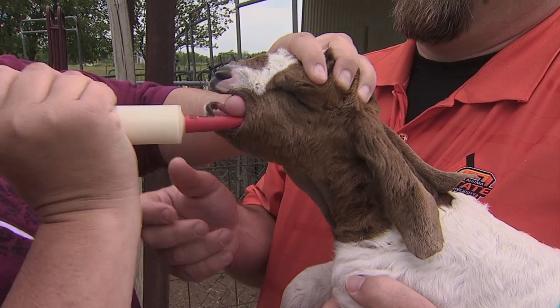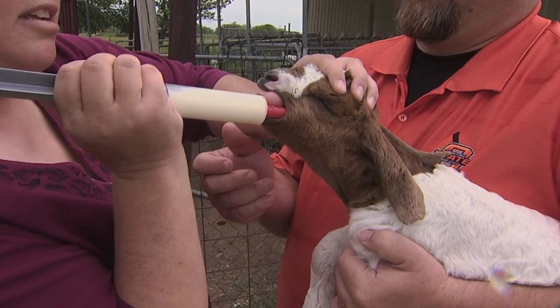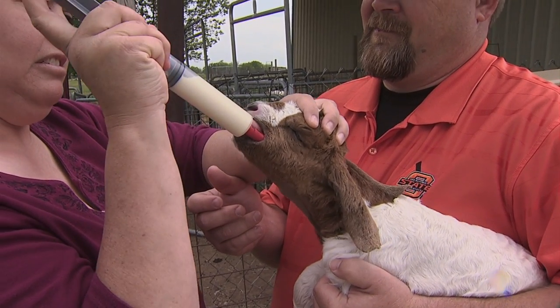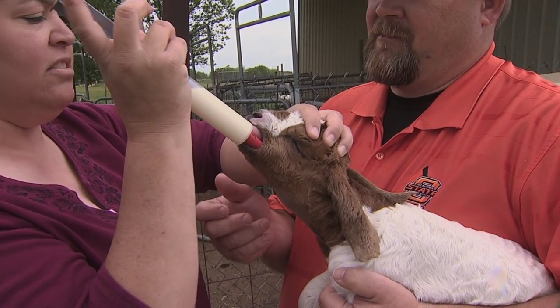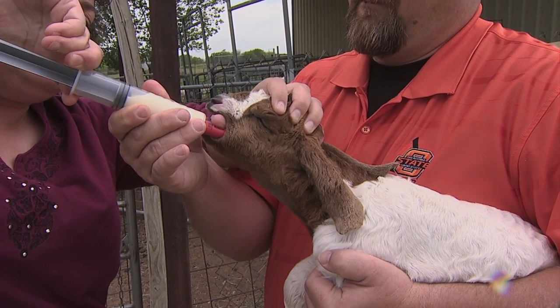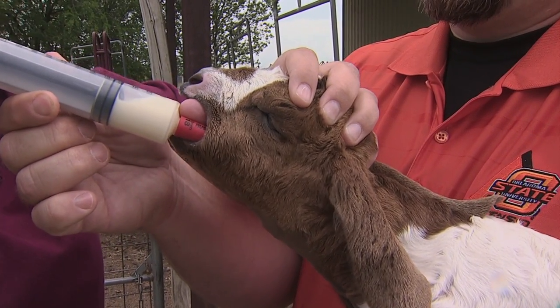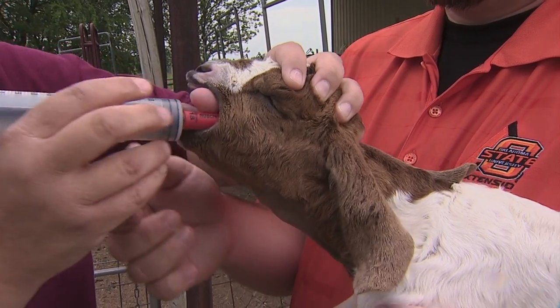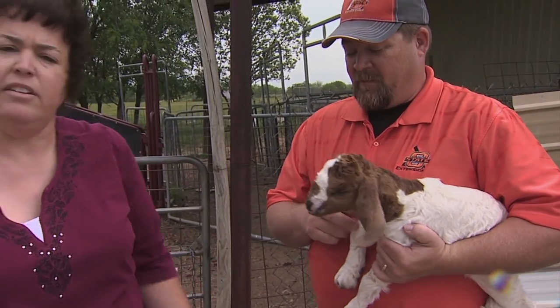It's hard at first to get that going in. The more hands you have the better. You may want to start out with a smaller amount. Get it all in, and then just bring it right back out. And now she's tubed.